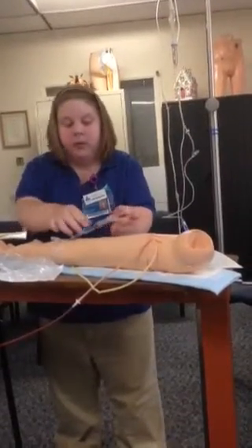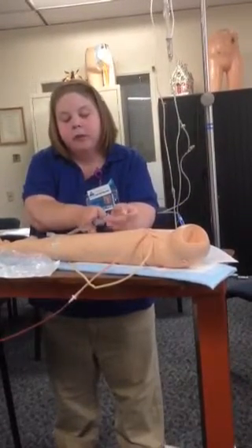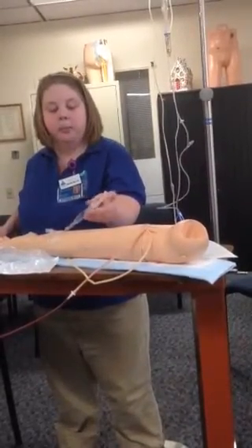I'm going to aspirate. I've gotten blood return, which means I'm in the vein. I'm going to push pause.